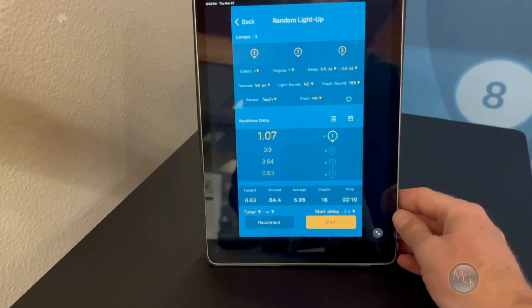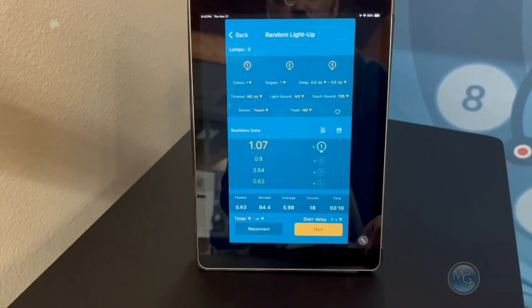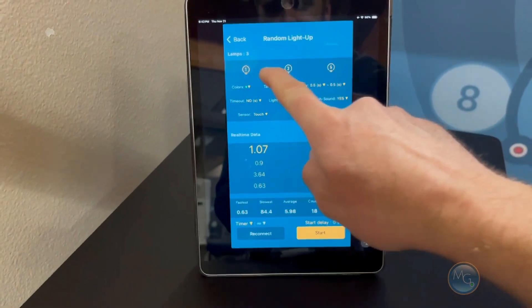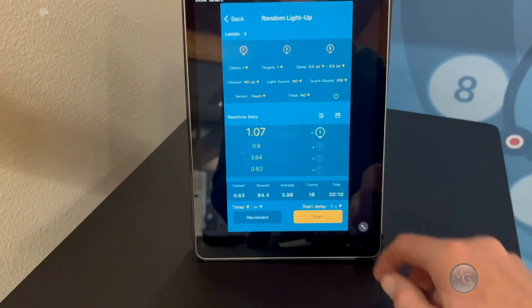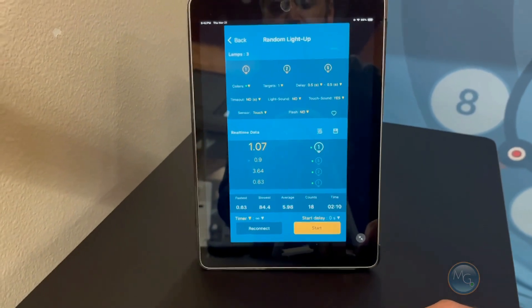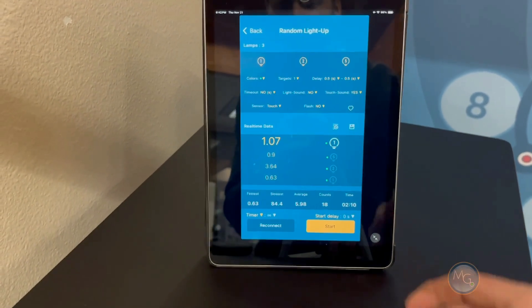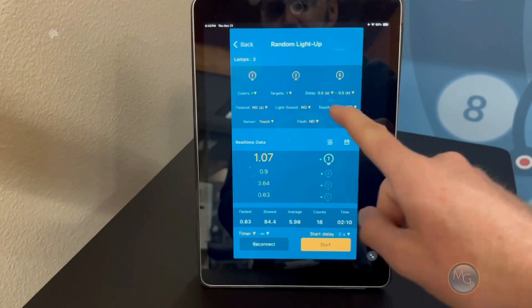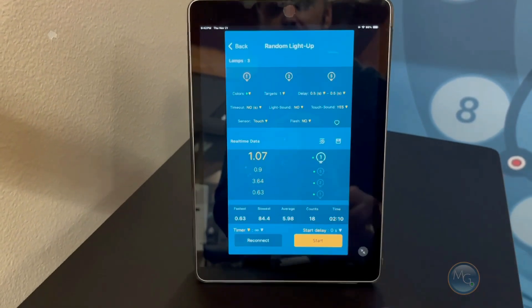Your data is going to be recorded on the Motion Guidance app in real time. So when you turn on the screen, you're going to see which targets are active. I have three targets and the real time data will be collecting information on how fast you reach the target. You can also manipulate the colors, how many targets you're using, and if you want them touch activated or laser activated.